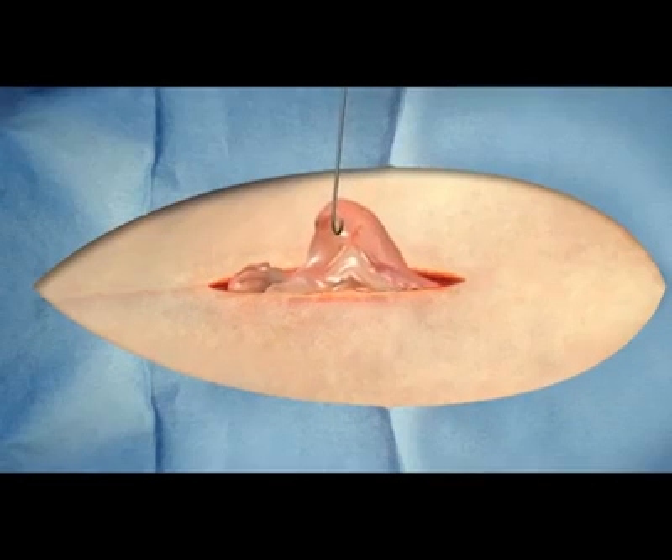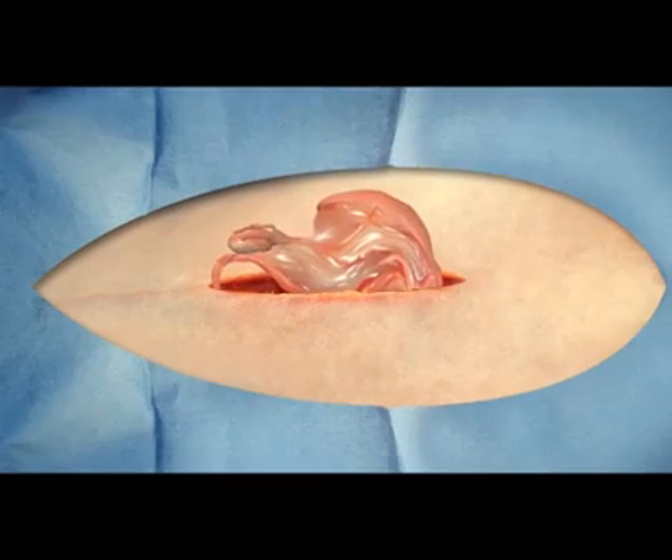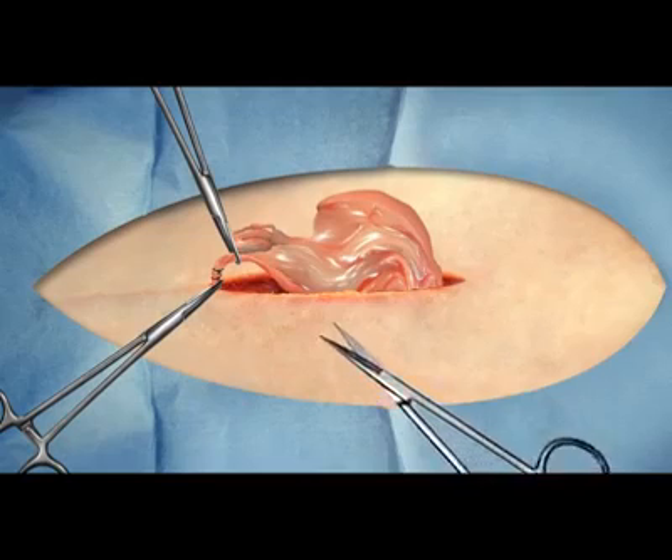The left uterine horn and then the left ovary are identified and gently elevated from the abdomen. Surgical forceps are strategically placed between the ovary and the kidney on the ovarian artery and veins. A ligature suture of an absorbable material or stainless steel clip is placed on the blood vessels to prevent bleeding.